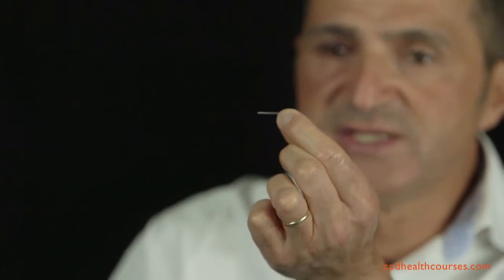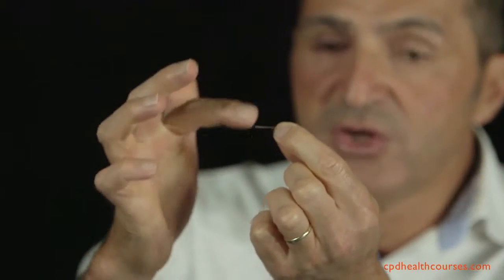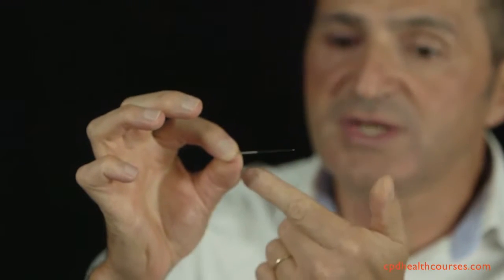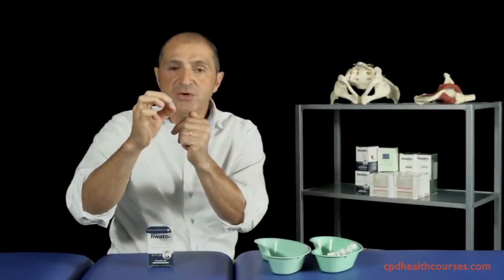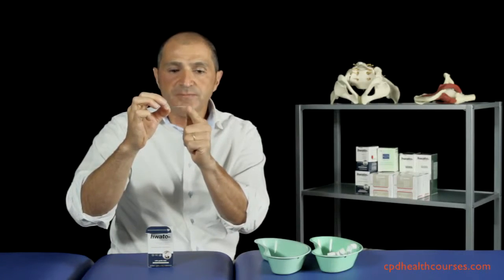In this case, it's a stainless steel needle, but they can come in other types, with copper around the handle. They can also come in plastic in this area here, which makes them lighter and non-conductive. Some needles can be used for other processes like electroacupuncture and need a metal handle. So this is a wound up handle, stainless steel, and the shaft is stainless steel as well.